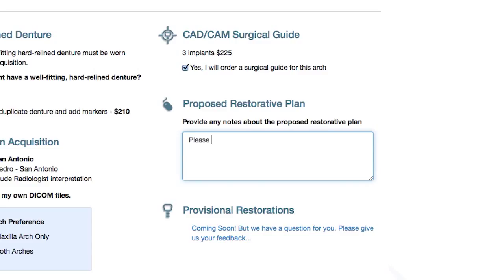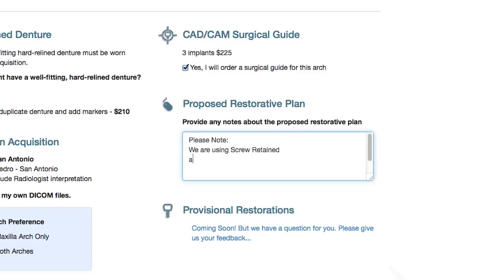Next, provide Implant Concierge with your restorative plans. Will it be screw-retained or cement-retained crowns? If it is a fully edentulous case, you will be using tilted or straight implant protocols. The more information that you provide your 3D case coordinator, the more accurate your initial treatment plan will be.